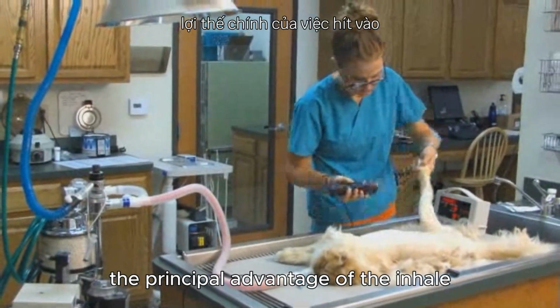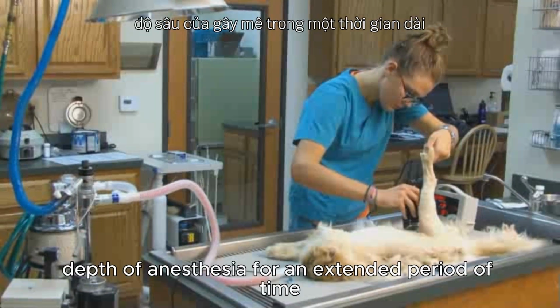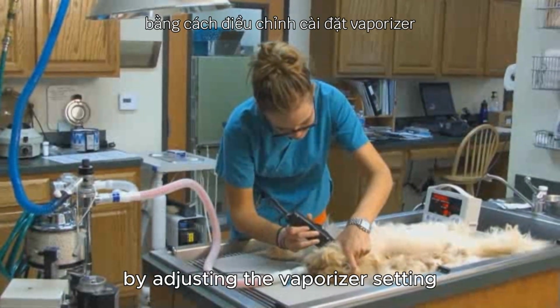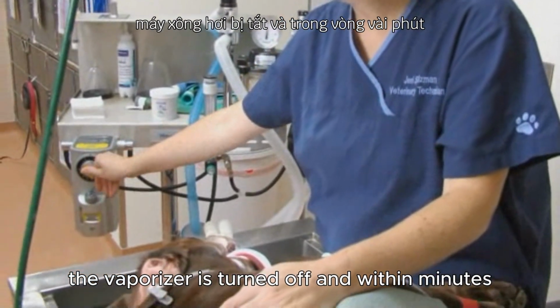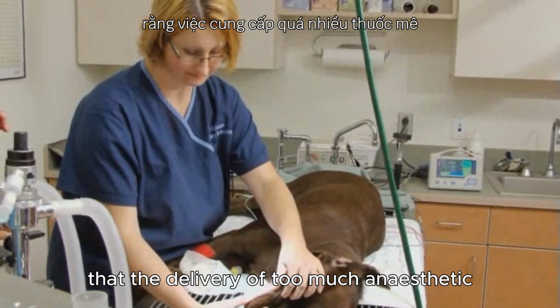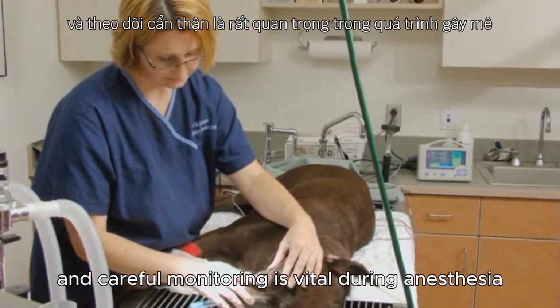The principal advantage of the inhaled anesthetic machine is that we are now able to control the depth of anesthesia for an extended period of time, even up to several hours, by adjusting the vaporizer setting. At the end of the procedure, the vaporizer is turned off, and within minutes, the patient begins to regain consciousness. It must be stressed at this time, however, that the delivery of too much anesthetic can be life-threatening, and careful monitoring is vital during anesthesia.